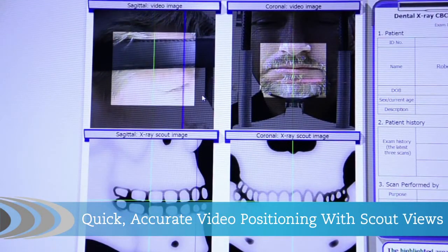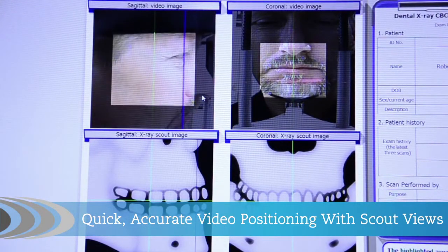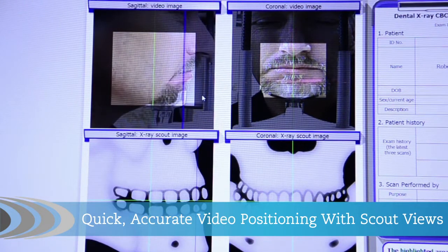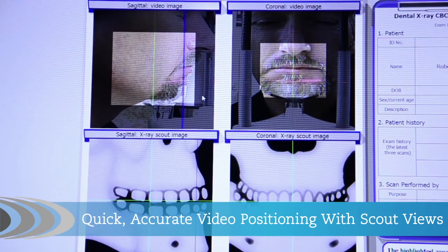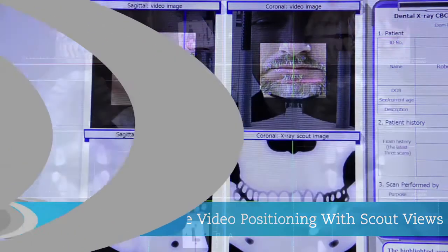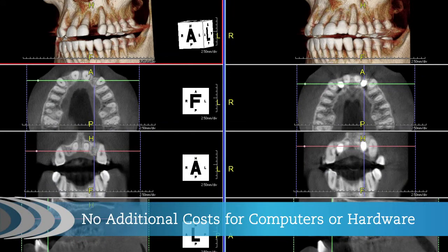Avoid retakes and increase patient comfort with the Eclipse Live closed caption dual video camera. Reconstructed 3D images are available quickly after completion of the scan rotation. The Eclipse includes two robust medical grade servers and doesn't require you to upgrade your office computers.